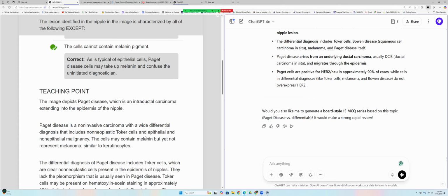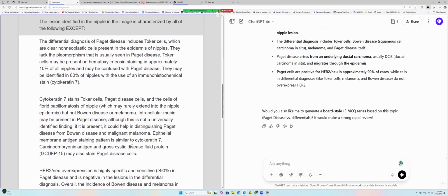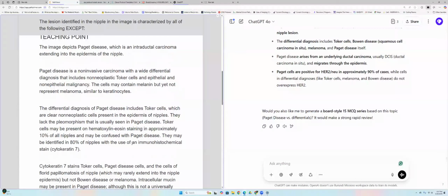Okay. Are you done with reading this, or should I? You can read now. Okay. Toker cells may be present. Yeah, let's continue.